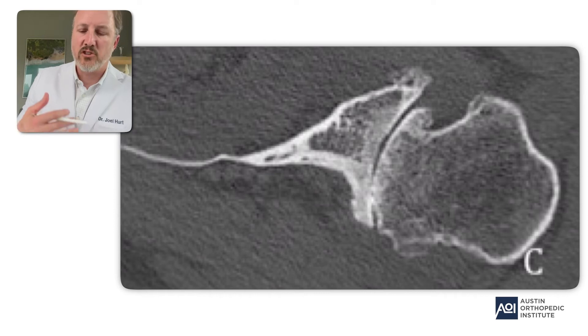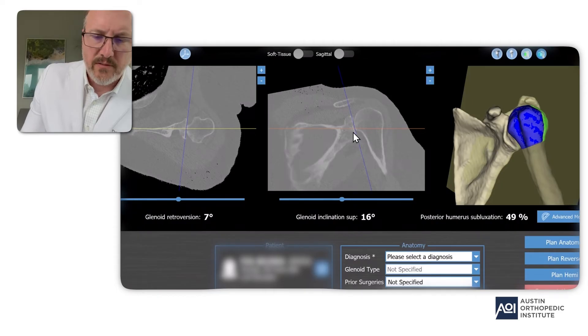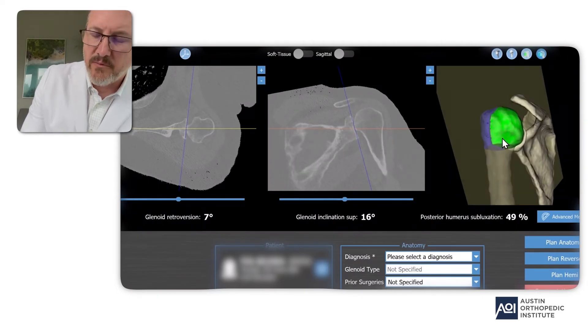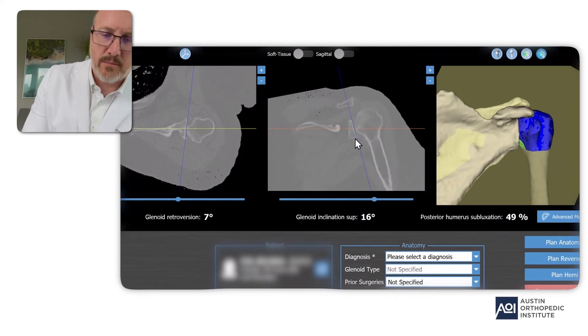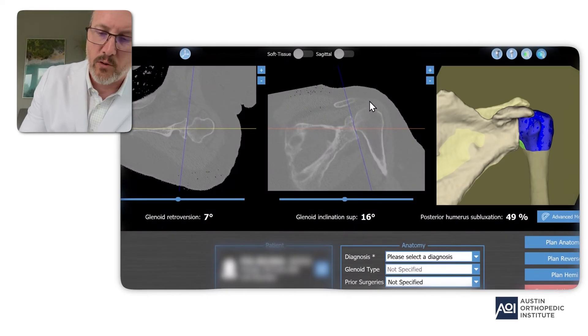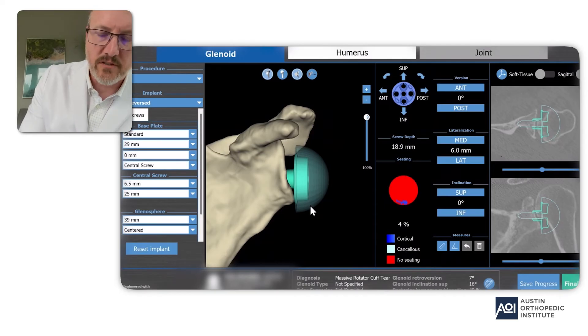Let me demonstrate how I actually do the planning in short form for my reverse shoulder replacements. For every single patient I record myself doing it and talk through it, so the patient can see what I'm doing for their particular case and watch it if they want. Here is one of my patients I'm doing a reverse shoulder replacement for. You can see cross-sectional views on the left and the three-dimensional view on the right. I notice on this patient that they have some proximal migration — the humeral head has risen up — which tells me this patient does have a large rotator cuff tear, and that's why I'm doing a reverse shoulder replacement.